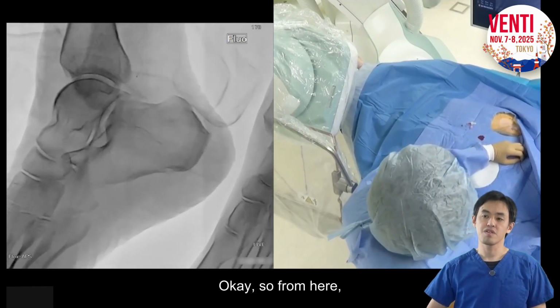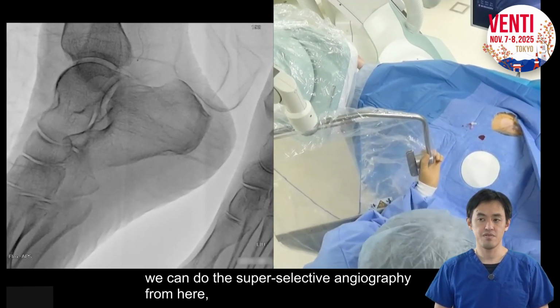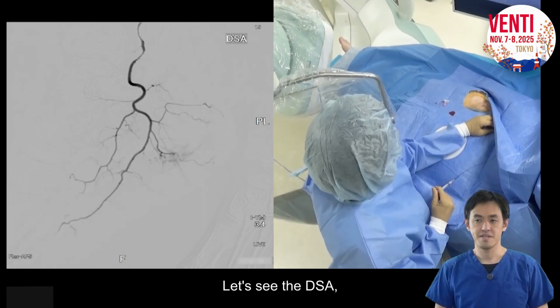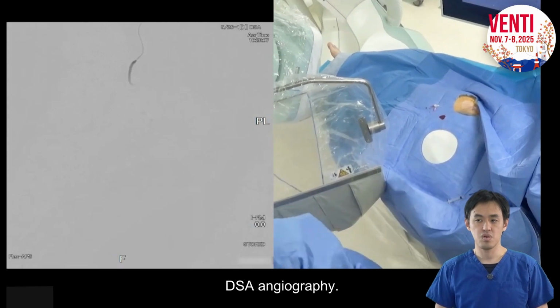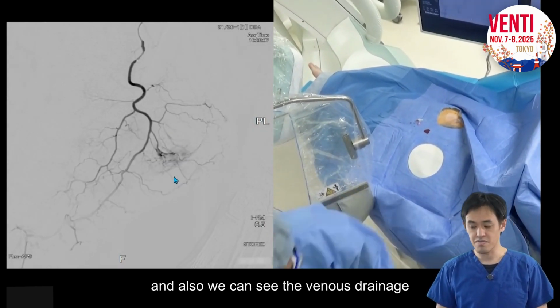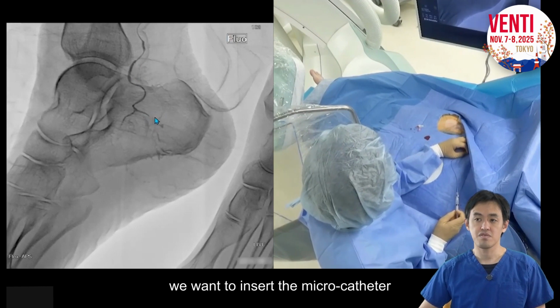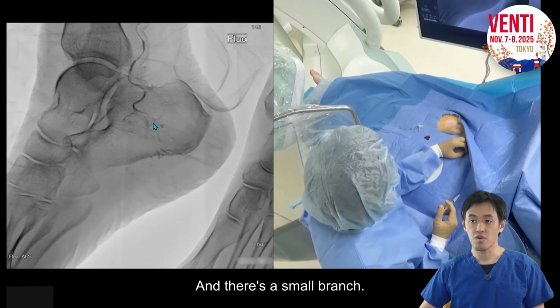Okay, so from here we can do the super selective angiography, the baseline angiography. Let's see the DSA angiography. We can see the abnormal brush, and also we can see the venous drainage as the target area here. And then we want to insert the microcatheter from here to this level. And there is a small branch.